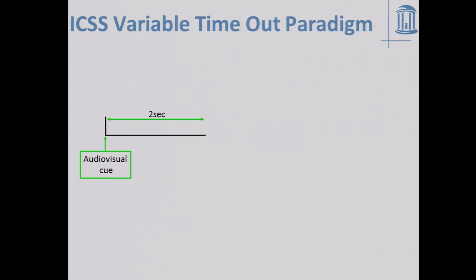So I want to show you one behavior here and let you see how spontaneous dopamine changes occur. Let me first show you the timeline of the experiment. We've taught an animal, a rat, that we are going to play an audio-visual cue. In the movie that I'll show you, you'll see this as a light going on. There's also a tone, though. And that audio-visual cue lasts for 2 seconds. At the 2-second point, a lever pops out, and the tone and the cue continue. And the lever, if the animal goes and presses the lever, it delivers the electrical stimulation that I have shown you earlier to itself. Okay?